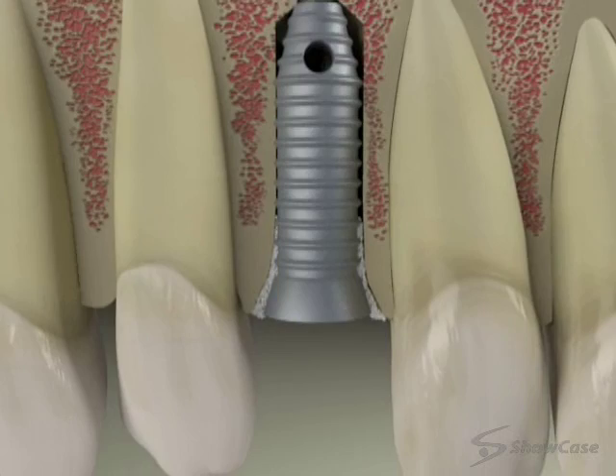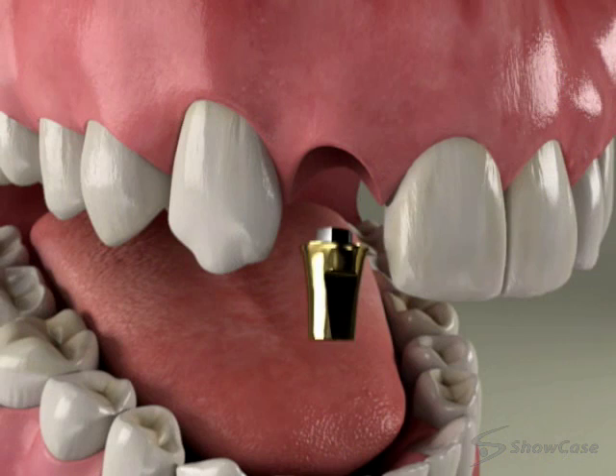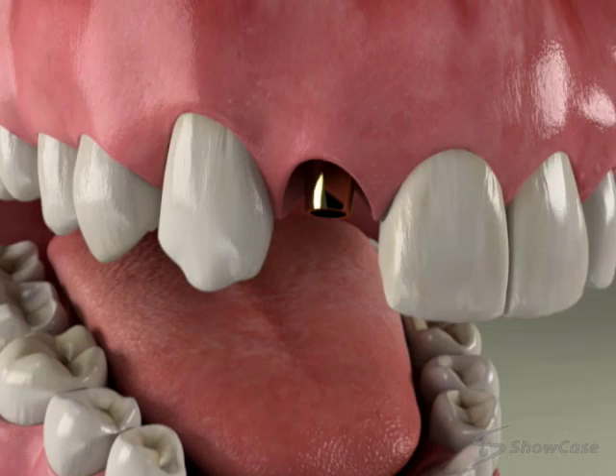A healing cap or an extension is attached to the implant. We then close the gums, and depending on the situation, we may place a temporary replacement tooth.